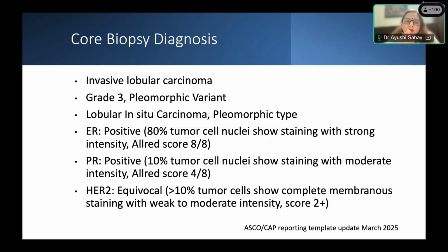then you can favor a lobular carcinoma if you do not have confirmation of E-cadherin. If it is looking very high grade and it is triple negative, then rethink your diagnosis before you call it a lobular carcinoma. That is why I pointed out that the majority of lobular carcinomas, including the majority of the pleomorphic variants, are usually hormone receptor positive. The triple negative and HER2 positives are extremely rare. So always rethink your diagnosis in light of these markers also, if you do not have a confirmation of E-cadherin.